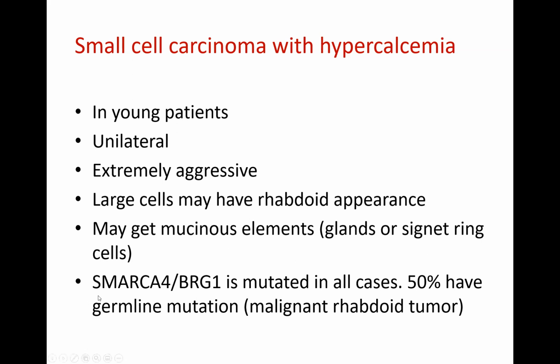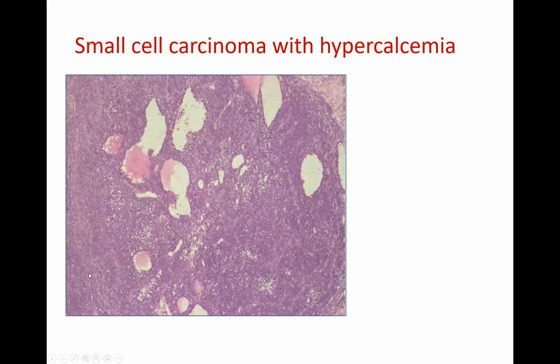So I think this is why we started to think of these tumors as really belonging to the rhabdoid tumor category rather than the name of carcinoma. So the tumor will present to you like this: blue tumor, very cellular, but it has holes. Look at the holes in the tissue. Aha. So now I mentioned holes before. Remember that case of juvenile granulosa cell tumor? It had a hole, and I told you that hole is important because it will confuse me. This is how it confuses me.